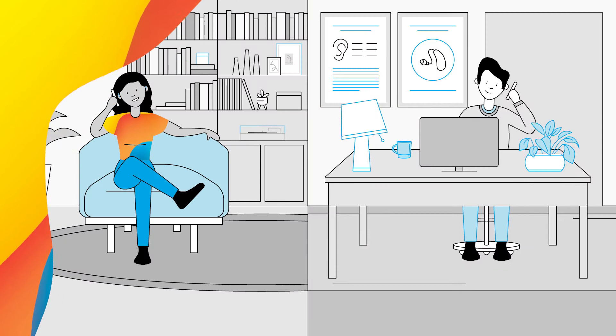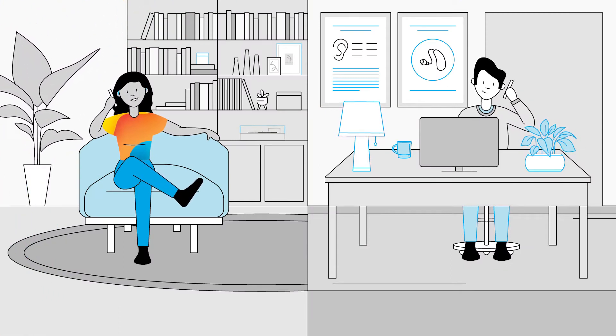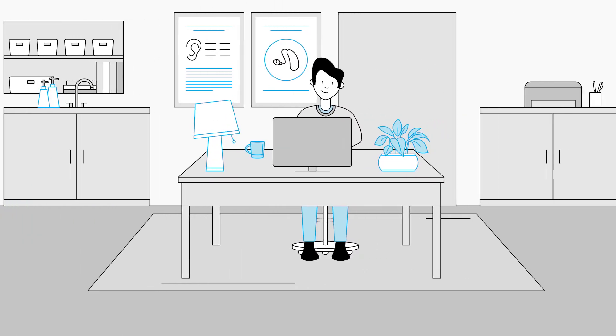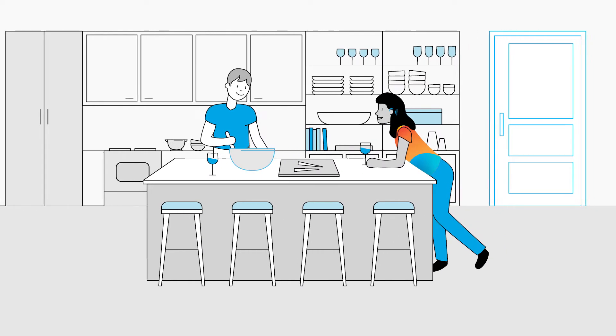Here's how it works. Have a quick call with your hearing care provider, or even just send them an email and talk to them about the adjustments you need. Your hearing care provider can make the changes from the clinic while you spend more time doing what you love.